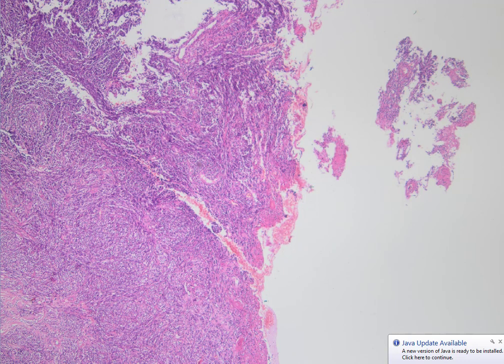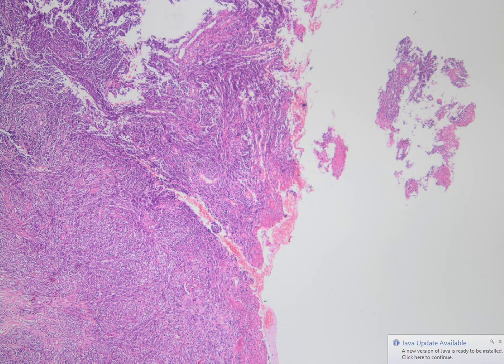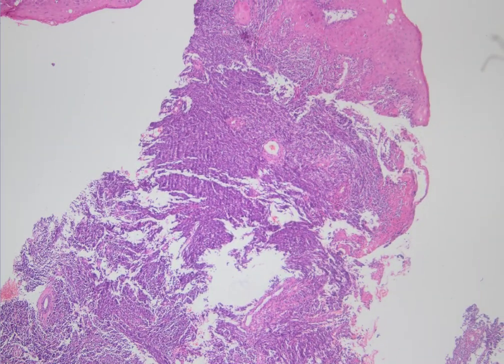And this month I'm going to share a biopsy from an elderly woman who had a gingival lesion, and the diagnosis was synovial sarcoma in the outside clinic, and it has been consulted to us.